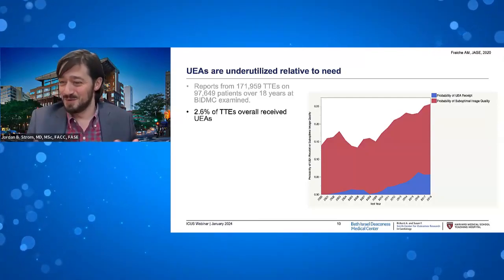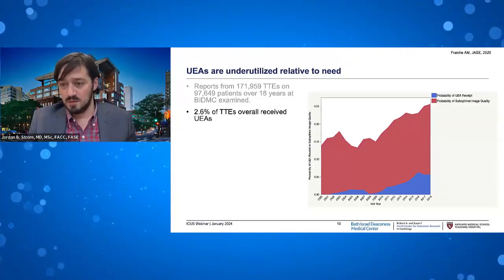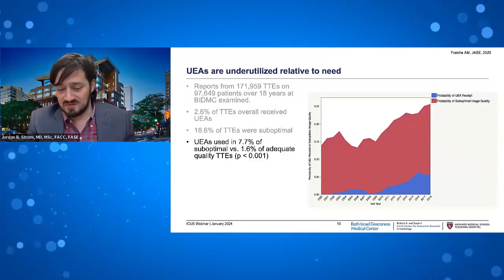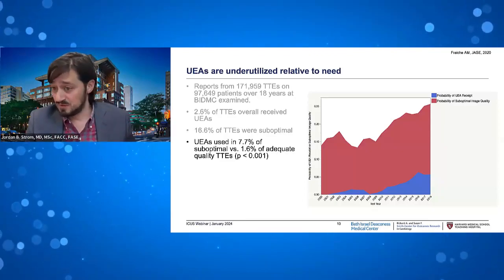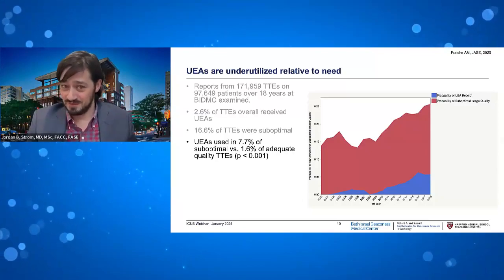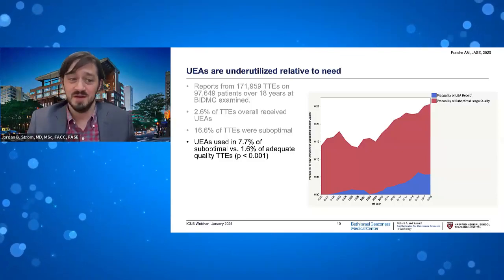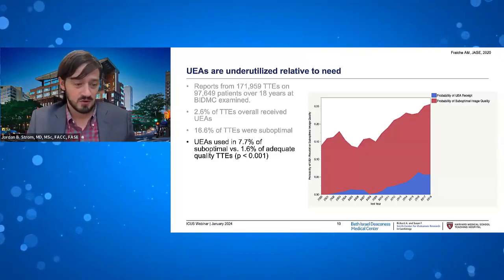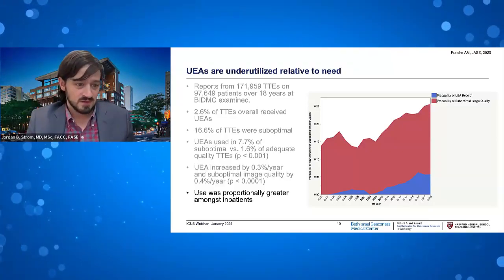Inpatients have IVs already, so it makes it easy to give the contrast and to use it. And of course, inpatients also have higher acuity. So this was sort of eye-opening for us in general. In this study, 17% of echoes were suboptimal image quality. We know that on average, 10 to 20% of the population had suboptimal image quality. That's no fault of your own. It's not a sonographer not getting appropriate images. It's just what the patient comes in with. And ultimately, while we use contrast more in suboptimal quality studies, we still had a big gap to overcome.